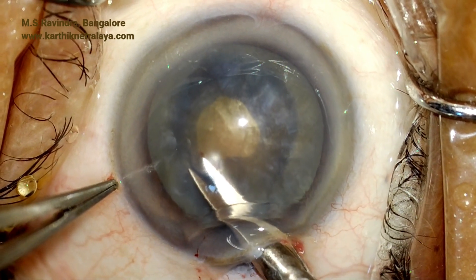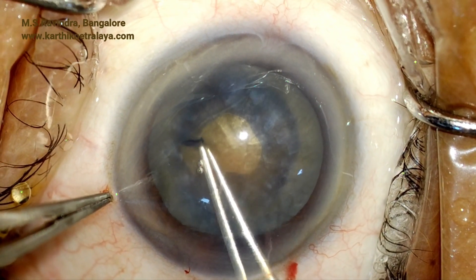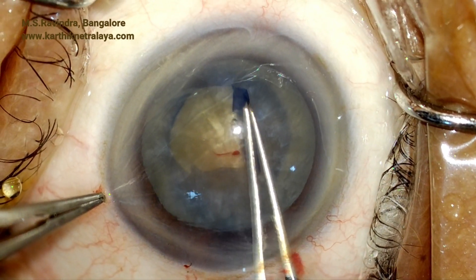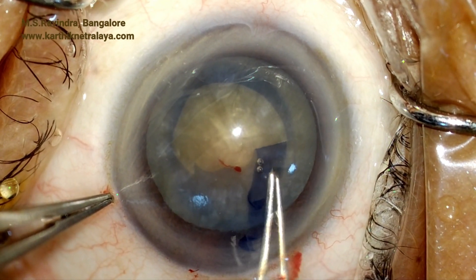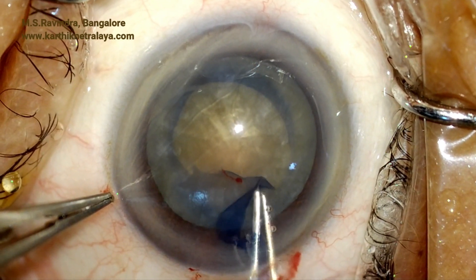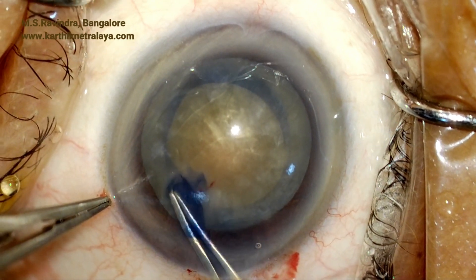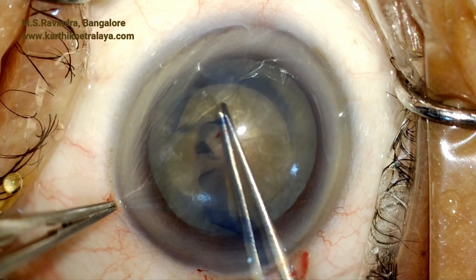Care is taken to ensure that the zonules are not pulled or pushed by lateral movement of the nucleus. A small nick is made in the rhexis and Utrata forceps are used to enlarge the capsulorhexis to adequate size. An adequate rhexis is very important here — it should not be too small, because there will be a lot of zonular traction when rotating the nucleus. That is the completion of the rhexis.